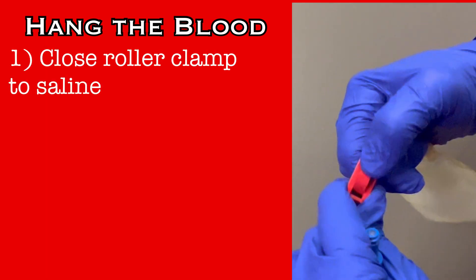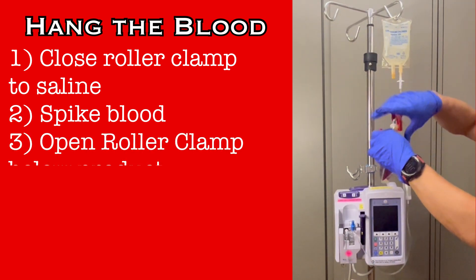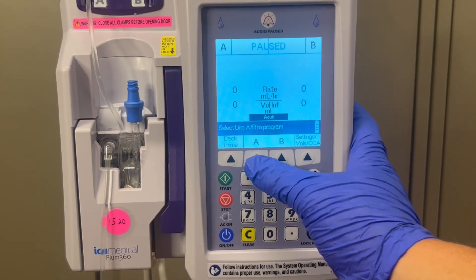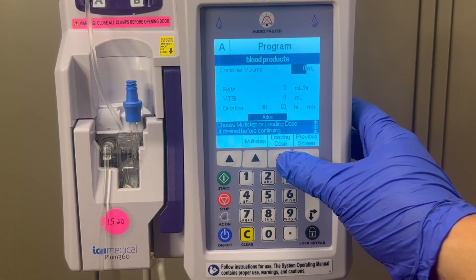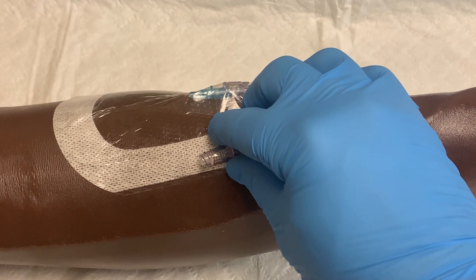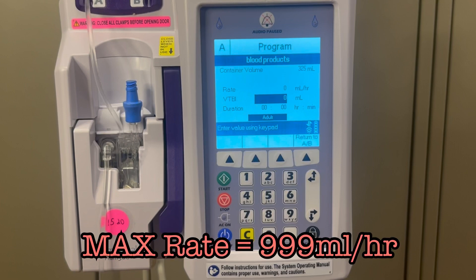Now hang the blood. Close the roller clamp leading to the saline. Use the remaining spike to access the blood product. Open the roller clamp below the product bag, and squeeze the filter chamber to prime some product into the chamber. Program the infusion pump using the drug library. Push the button for the A line and use the soft keys to choose blood products from the available list. You'll start by entering the total volume of the bag, which can be found on the sticker attached to the blood product bag. Every unit of blood is not the same, so always verify the volume before programming. Now you'll need to prime the entire line with blood. Make sure the IV is disconnected from the patient, cover the IV with a swab cap, and then return to the pump. You can use the pump to quickly prime the line by having the detached IV line run with the maximum rate of 999 milliliters per hour.